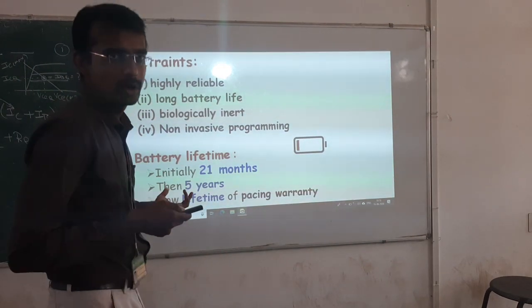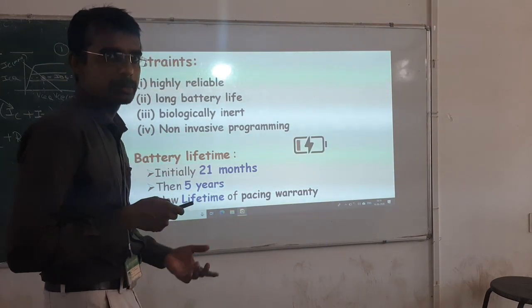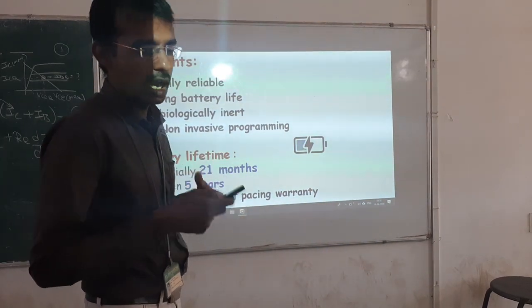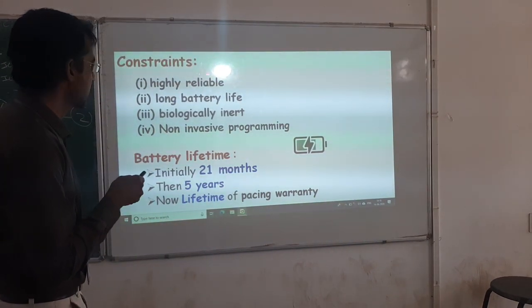So it's similar to a pacemaker. There is only one thing: it should be highly reliable. Reliability means trustworthy. You cannot operate and take it out again and again to program it, or let it malfunction. Malfunctioning cannot be allowed, as that itself kills the person. So it should be highly reliable.